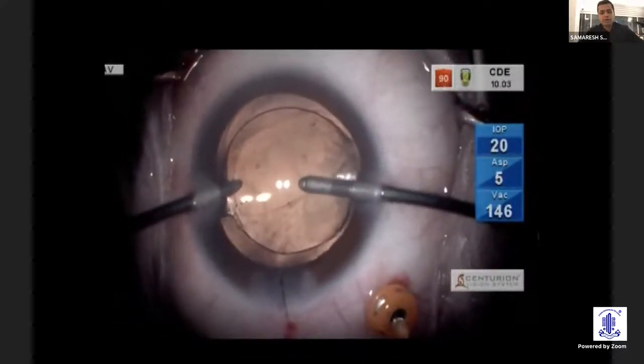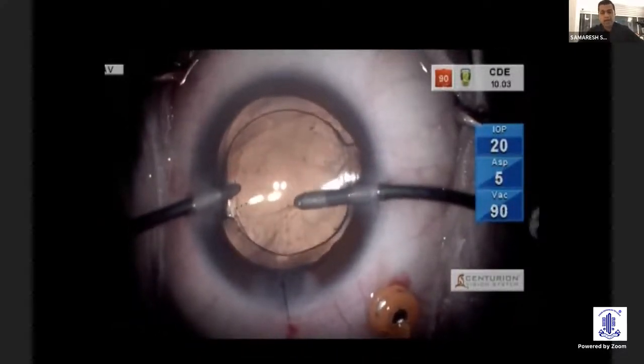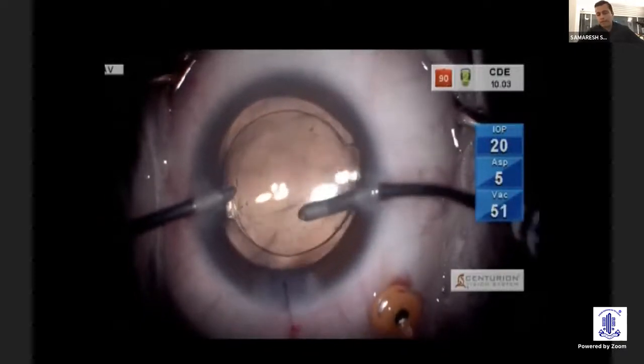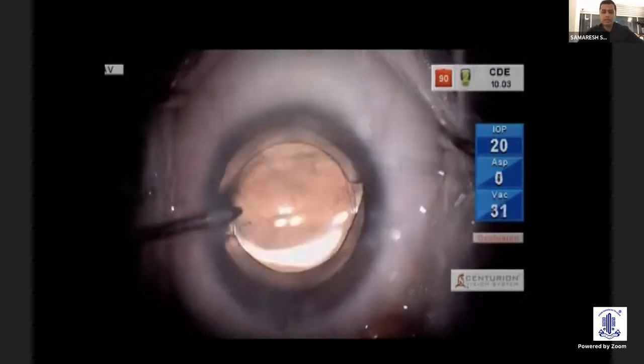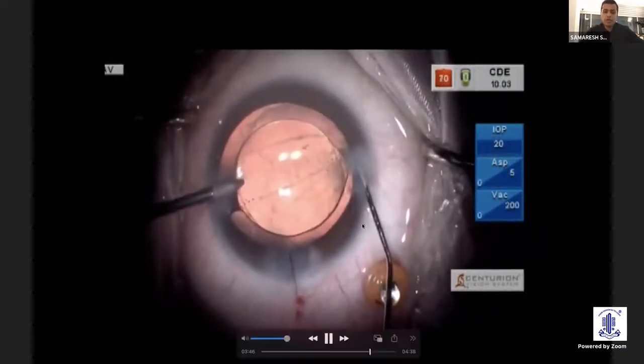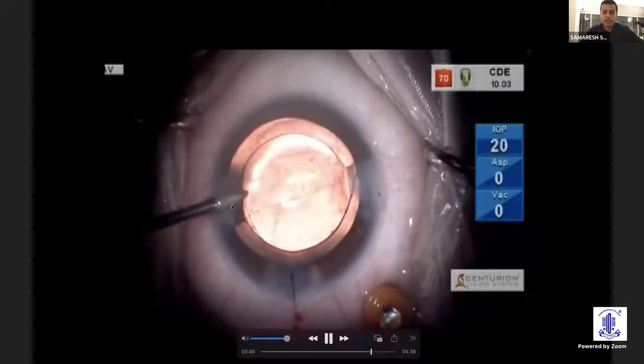I'm removing whatever little viscoelastic was remaining behind and also removing the triamcinolone. Again, whatever triamcinolone is left behind in the anterior and posterior compartments, if at all, is going to prevent further inflammation. It's also a good idea to hydrate your incisions with your irrigation in place.